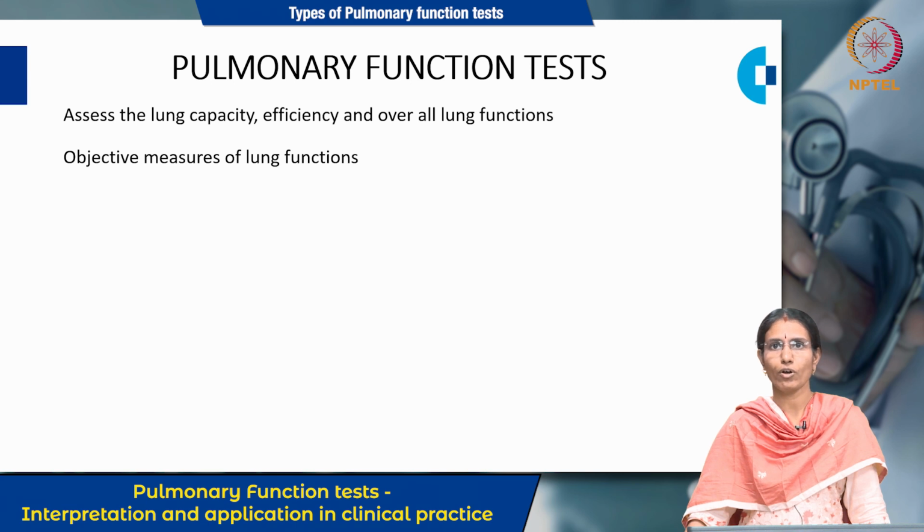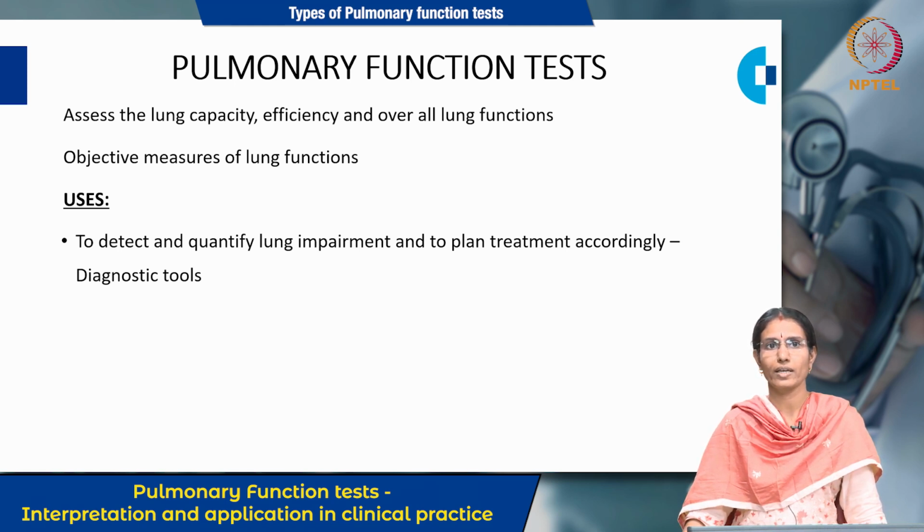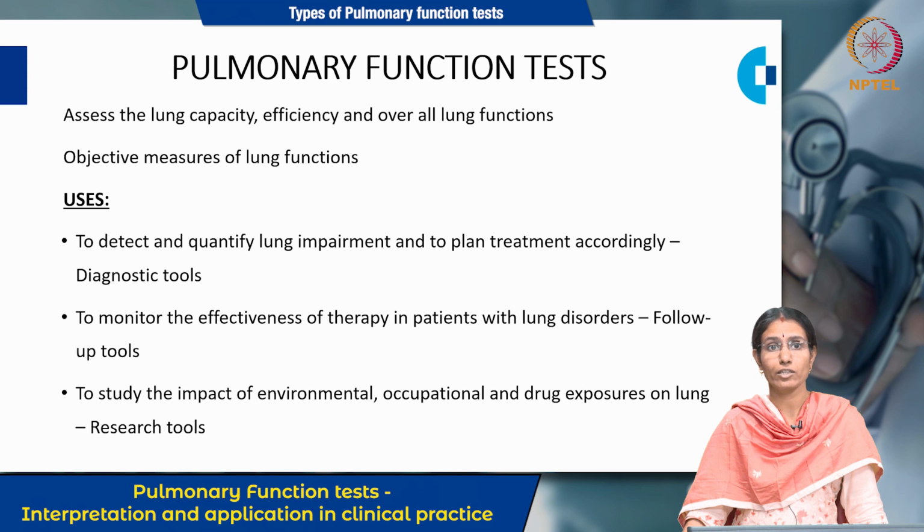What are the uses of pulmonary function tests? They serve mainly as diagnostic tools to diagnose lung disorders and to plan treatment accordingly. And after the treatment is begun, to follow up the patients too. So, they serve as follow-up tools, and it is also widely used as a research tool to study the impact of environmental, occupational and drug exposures on lung. So, these are the uses of pulmonary function test: diagnostic purpose, follow-up purpose and research purpose.